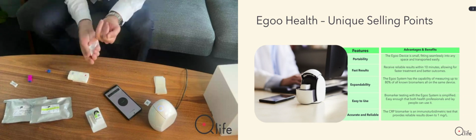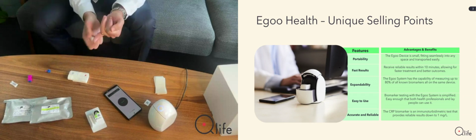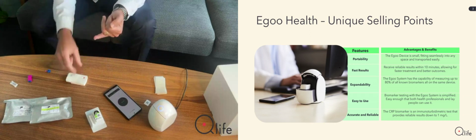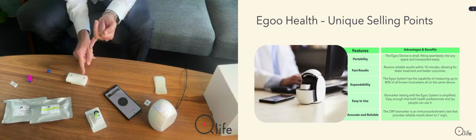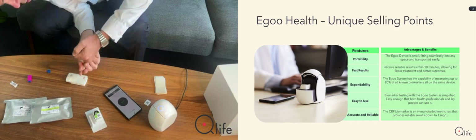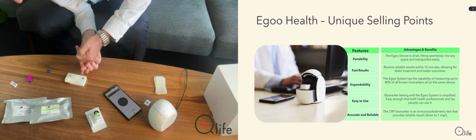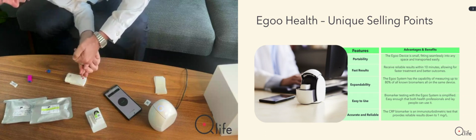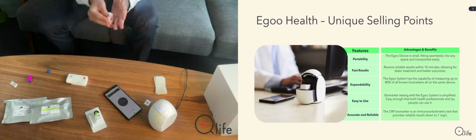And we designed these Egoo collects so that they have indicators for when there is enough blood. And this indicator here next to the inlet should start to get red when it has enough. So it doesn't look like it has enough at this time. So I will put a little more into it. Yes. Here it comes. Yeah. That's it. That should be more than enough. And then it starts to get red.